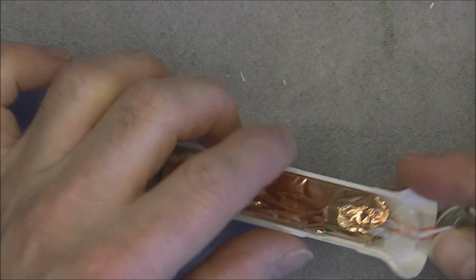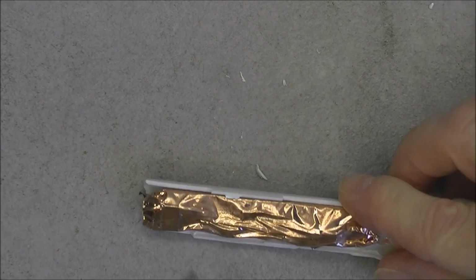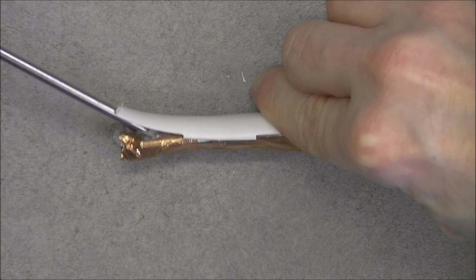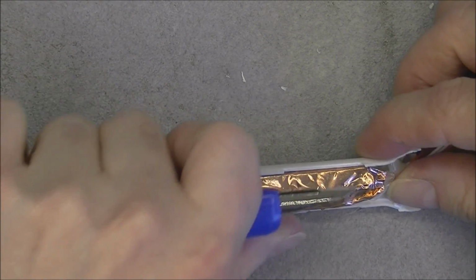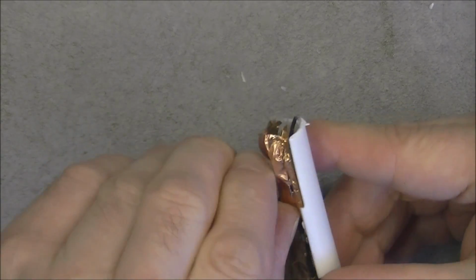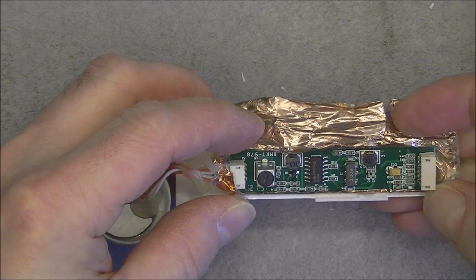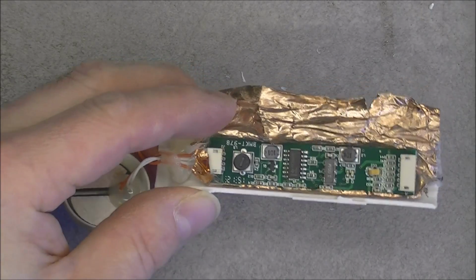Okay, so I am curious to see what we have inside this copper foil. By the way, it is glued again, very well glued even, so maybe the easier way will be to cut on the edge here and unwrap it. Here we are. So your guess is as good as mine.